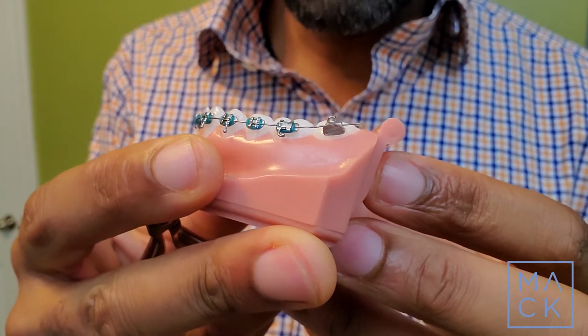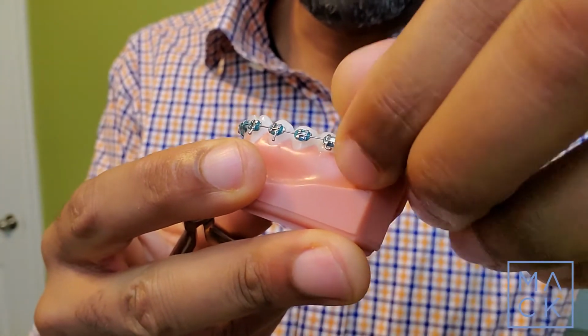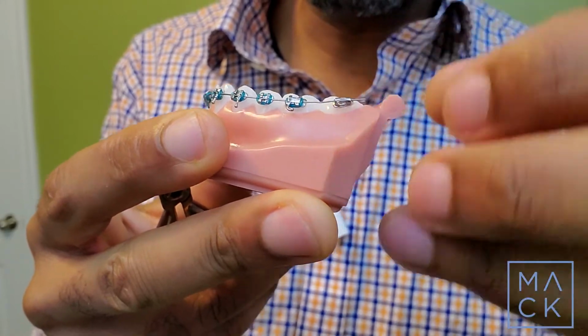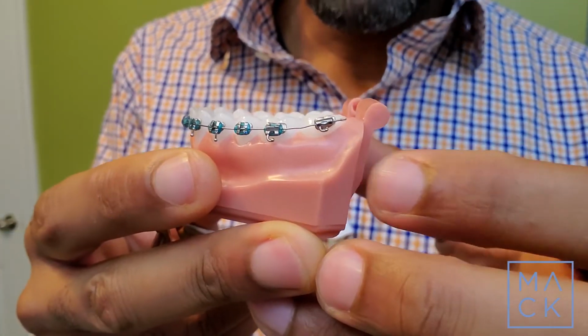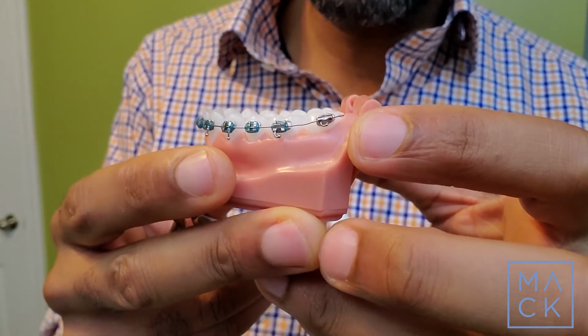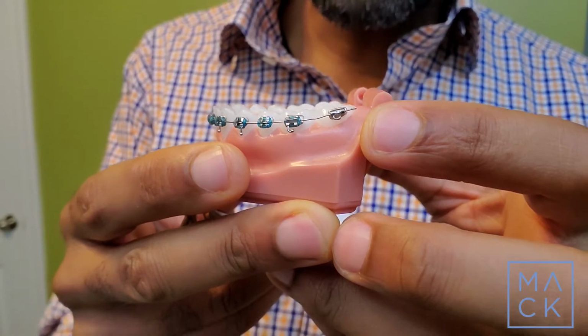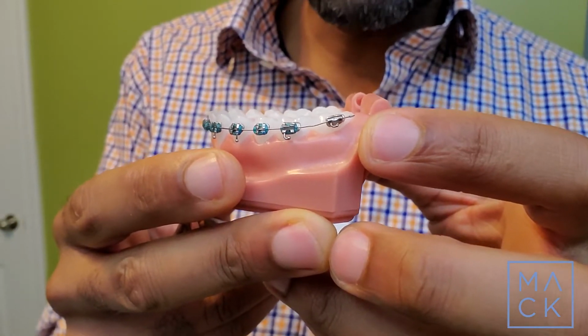First, if you can, we'd love for you to keep everything intact. So start by seeing if you can get the wire flipped back over and more comfortable. Once it's flipped over, it's going to be much more comfortable and you can use wax to cover it as needed. We've linked to that. But sometimes that's not going to be quite enough and you might actually have to cut the wire.